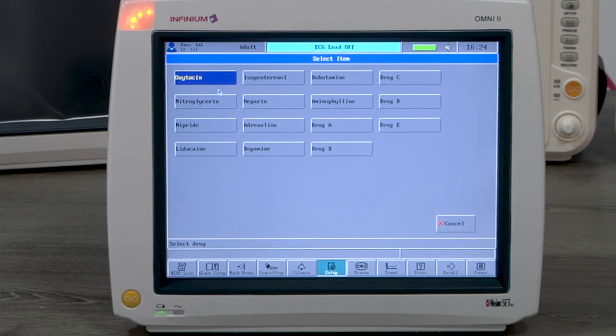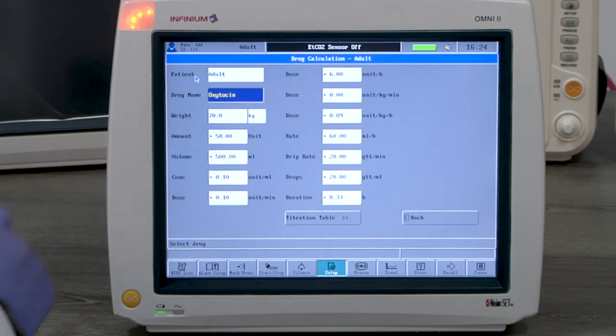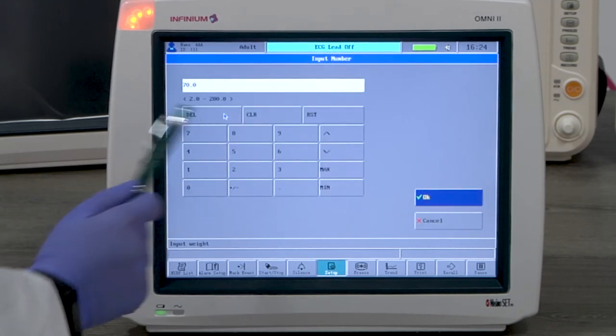Drug B, drug C, drug D, or drug E. Here we'll use oxytocin as an example.